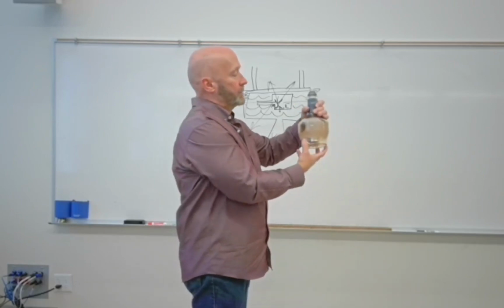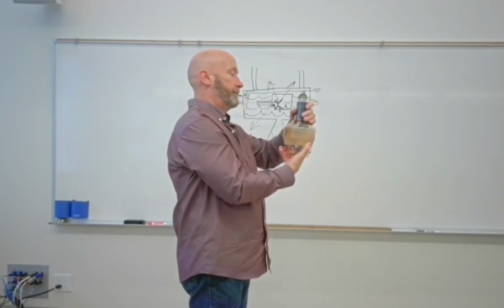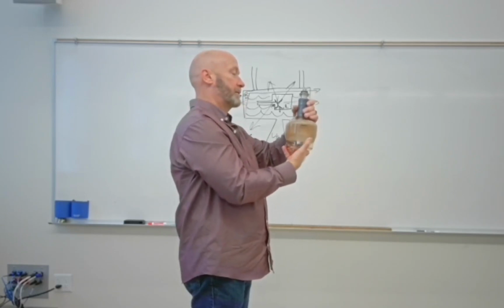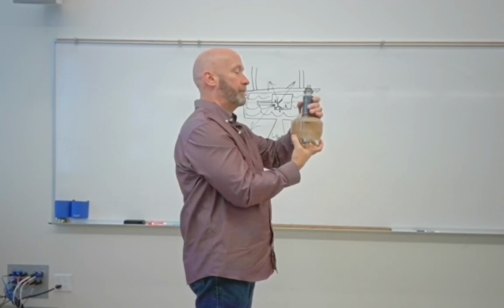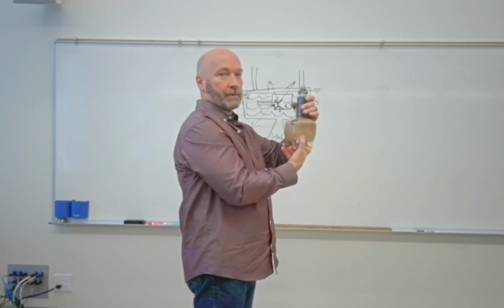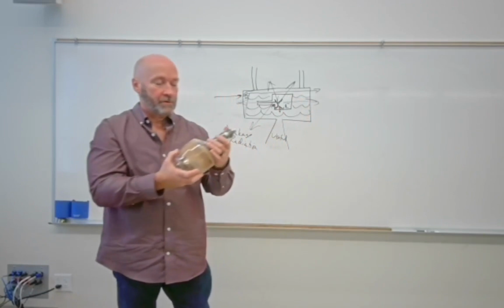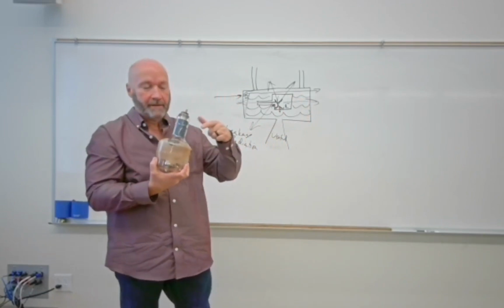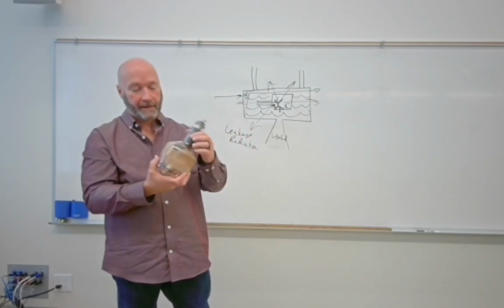Keep your eye on that dot and just rotate this thing around. What you'll find is that this thing is so well balanced that with just the slightest amount of movement, the X-ray tube will swivel, pivot, rotate. So it doesn't take a whole lot. It's well balanced, and also it has to rotate on things. We'll talk about that in a bit.